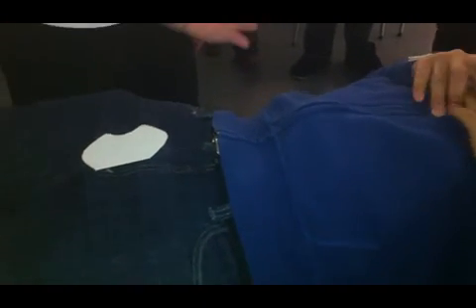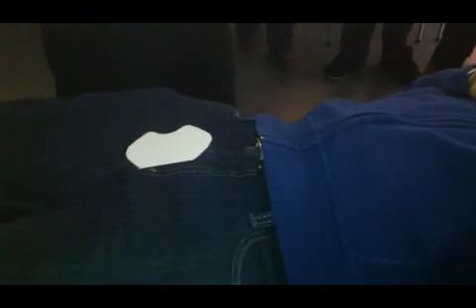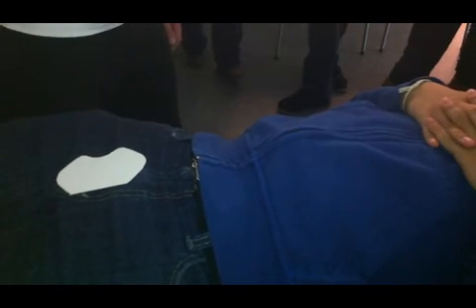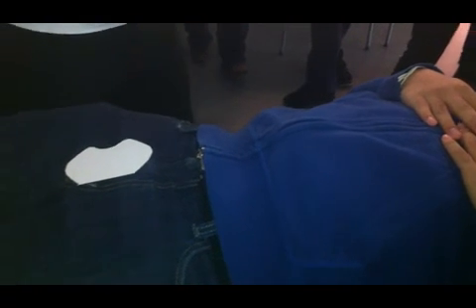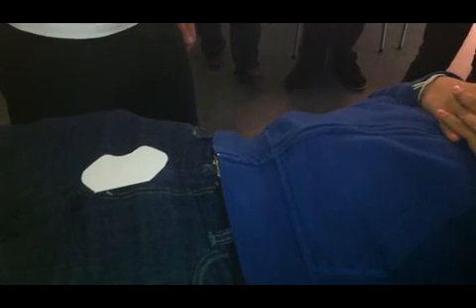But if you work at it and you understand the anatomy behind it, then you'll be able to shield pretty comfortably without any problems. But you do have to understand the anatomy. Some people are just too lazy to get it, or some people never learn as students, and they never venture forth to figure that out on their own. I didn't learn this as a student. I learned this as a tech after a while.